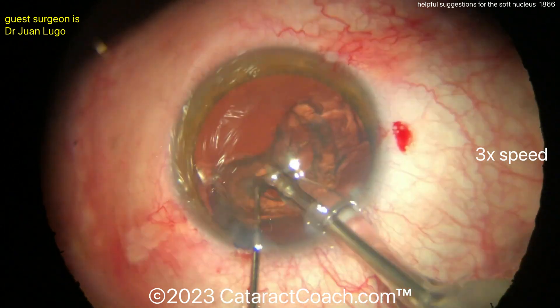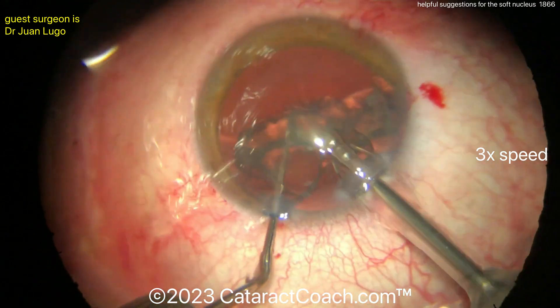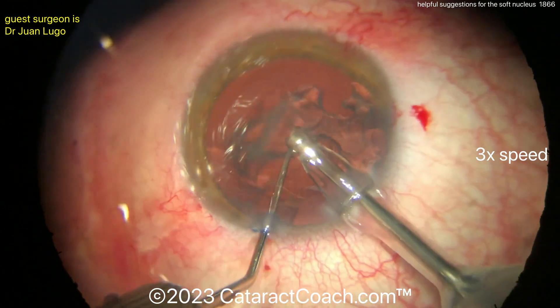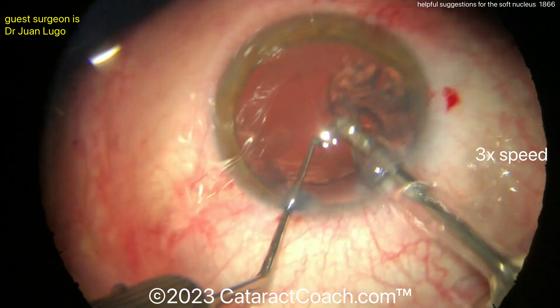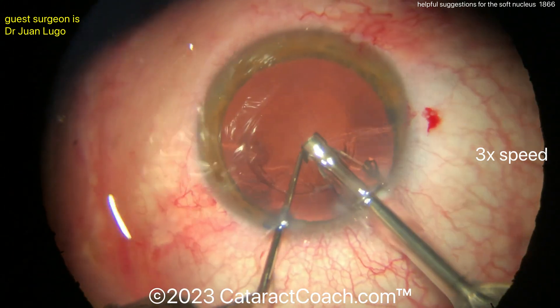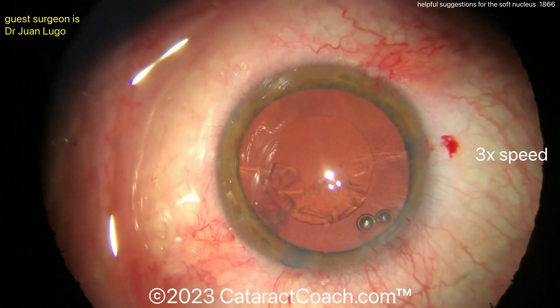That looks great. Be careful of that epinuclear shell — bring that up. Try to operate at the iris plane; the surgeon is doing a very nice job of that. So for a soft lens, that's the number one take-home message: get that thing out of the capsule bag. Hydrodissect, hydro-delineate, get it into that pupil zone — that iris plane. That's your safe zone.